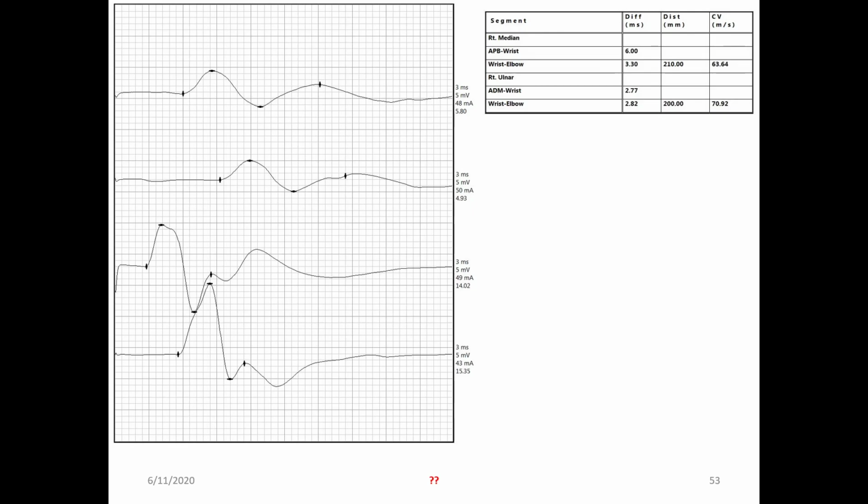Now, you can see a report of common report generation. These are median nerve potentials, so you can see they are quite right, as compared to the third and fourth potentials, which are taken from the ulnar nerve. You can compare, this is quite prolonged, because of latency prolongation. And this is quite near, or quite to the left side, because these two are ulnar nerve. Third and fourth are ulnar nerve; first and second are median nerve. If all four are affected and all four are shifting to the right side, that is polyneuropathy.